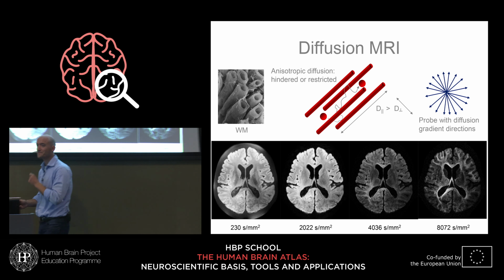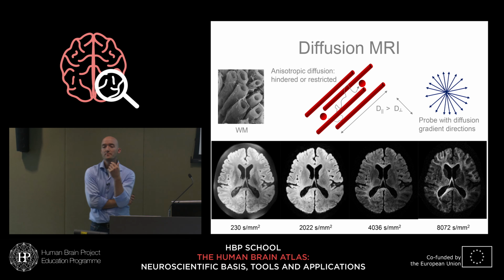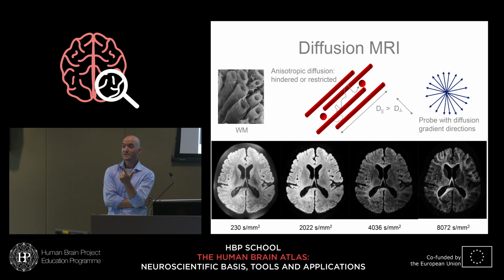Yes. So what is the maximal B value that you can obtain? This is a pure trade-off. Higher B value costs SNR. Higher resolution costs SNR. If you measure longer, you win SNR again. So it all depends on the resolution that you want.